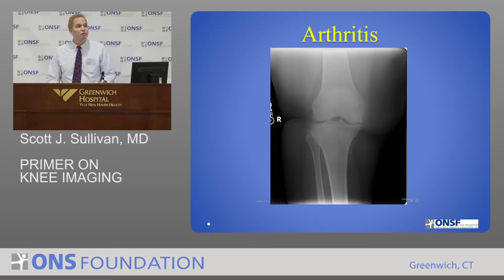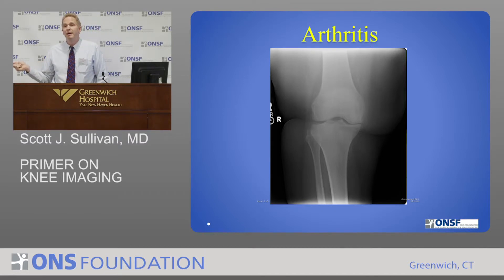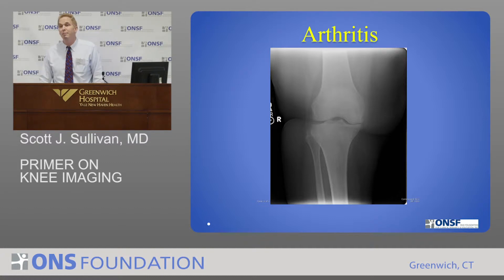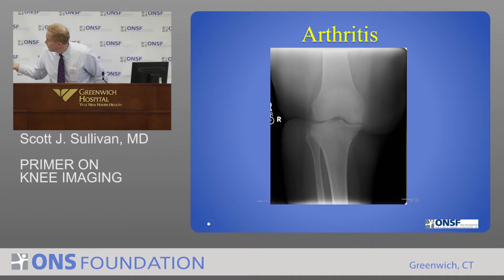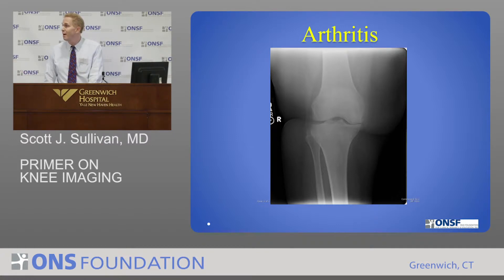The two major reasons people have these x-rays done are arthritis and trauma. This patient has osteoarthritis — not osteoporosis — and has lost their cartilage in the medial part of the knee. The x-ray is a very good test for seeing that. The person has osteophytes, some bony changes, sclerosis below the end plate. You don't need a lot of other imaging for this. You can also see from the soft tissues that the patient is probably in the high 200-pound range, which correlates very well with weight-bearing on cartilage and wear and tear.